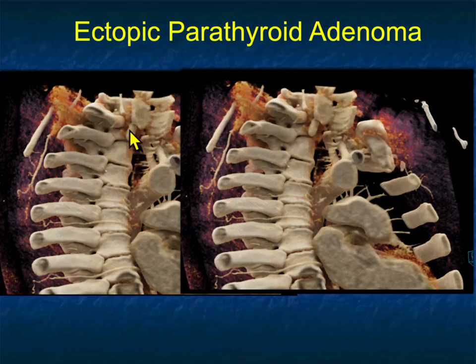You could see why finding this is so important. If you're the surgeon, you now know exactly where to go. You can really have a limited field of view, operate so the patient has fewer complications. If you don't know where to look, you're going to have a much wider area that you need to explore, and the surgical wound will be a lot larger.